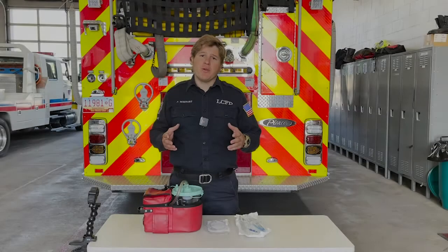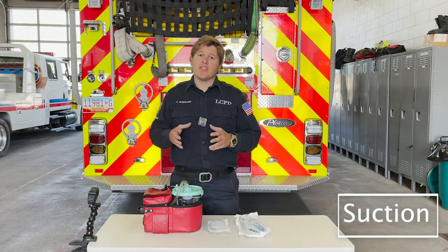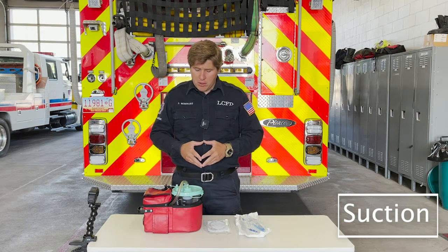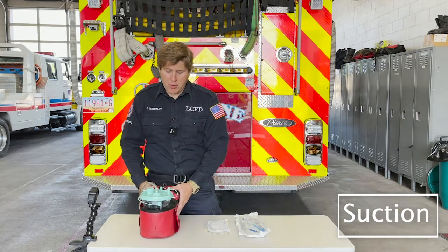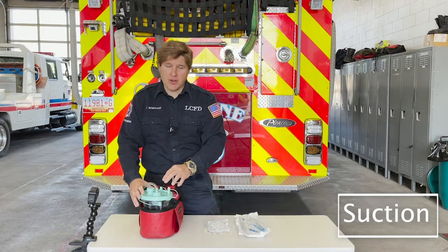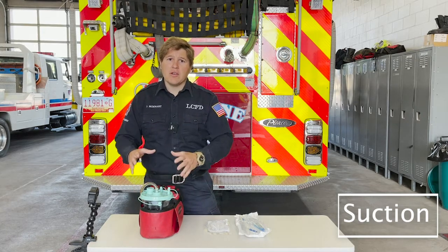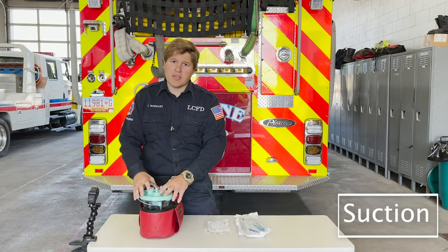The first thing when we approach a patient to manage the airway is that we approach from the head. We're going to show you techniques in other videos on how to manage that airway, but I just want to go over the first letter of that acronym, which is S for suction. The first thing is, of course, your suction unit. We're going to put out a video to show you the insides and out of this, so you should be very proficient in this, understand when it fails and how to fix it, and be able to use it in a very stressful environment. The more practice with this, the better you'll be at suctioning and maintaining someone's airway.